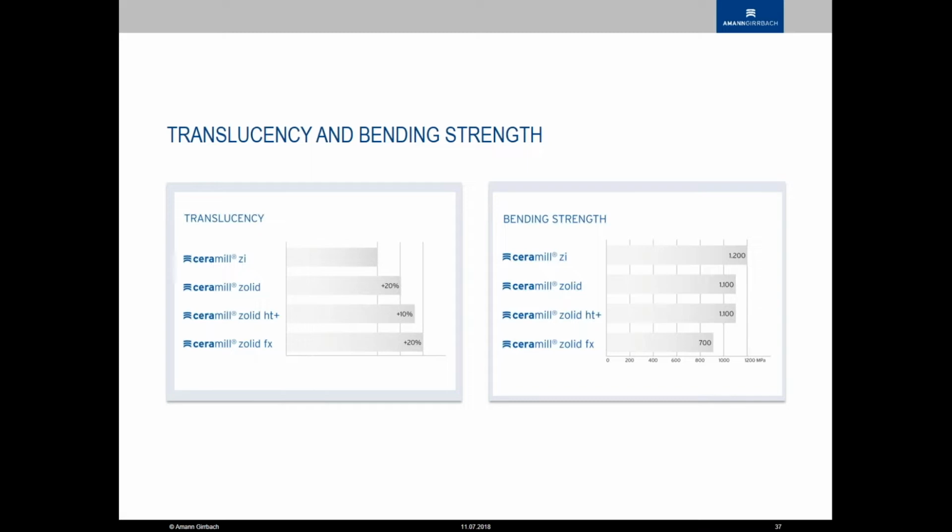And this slide here, if you know which is which, I should have maybe placed here, but I can show you. Low translucent, high translucent plus or HT Plus, and super high translucent. And then you can see exactly what I just said is happening. The very low translucency, very strong; very high translucency, very quote unquote weak. The grains in the material are larger usually on a more translucent zirconia, and smaller and more stable on a more opaque and stronger zirconia.